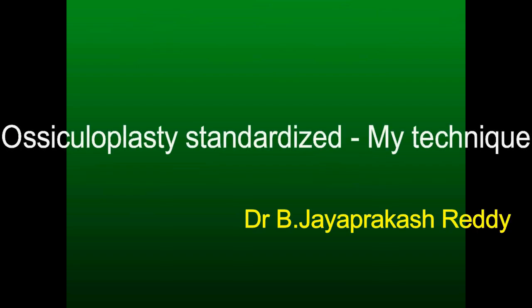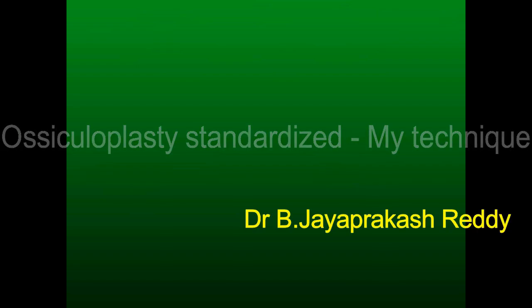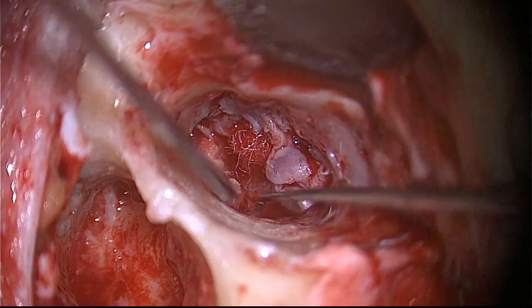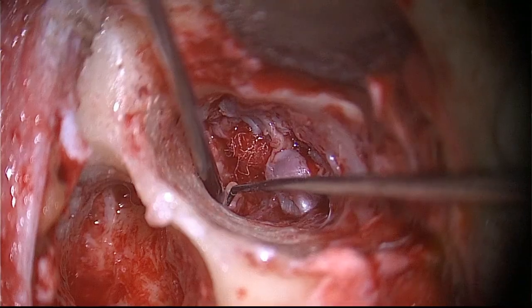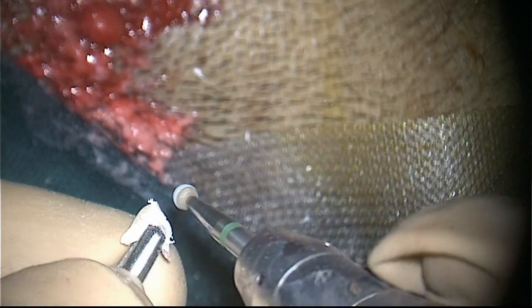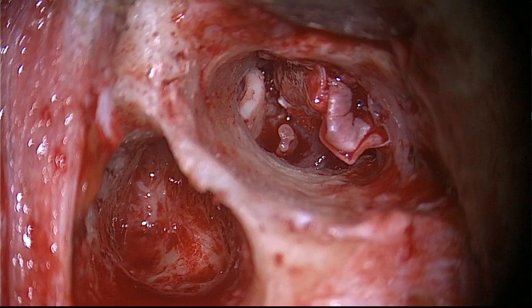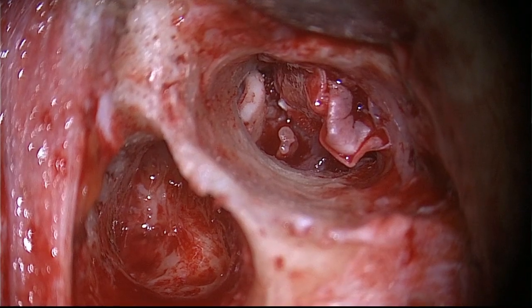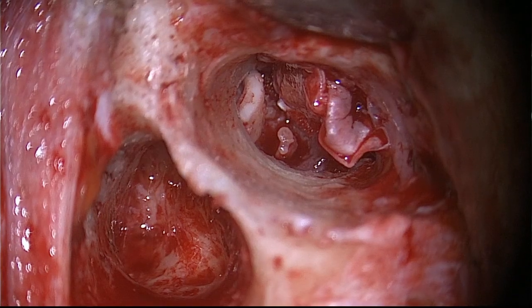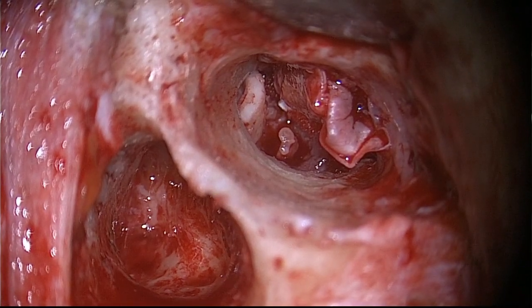Good morning everyone. In this video I will be showing the way I do ossiculoplasty. Ossiculoplasty forms an integral and important step in tympanoplasty surgery. However, various methods, various implants and various materials like homograft, allograft, autologous materials have been used to reconstruct the sound conducting mechanism, that are ossicles, in the field of otology.